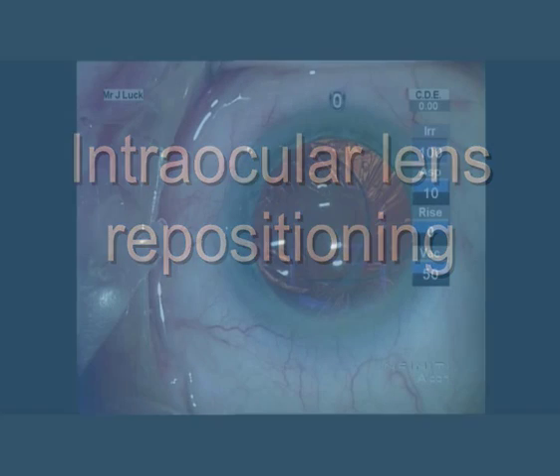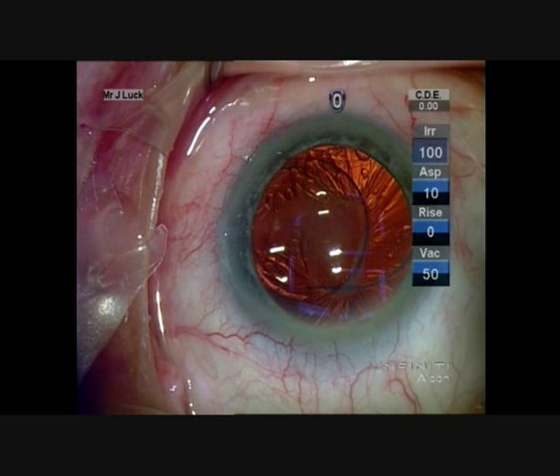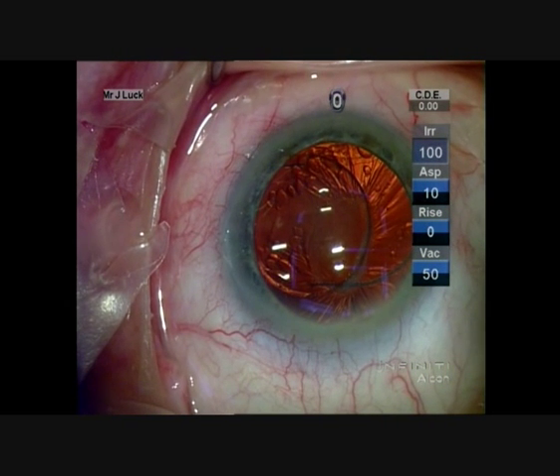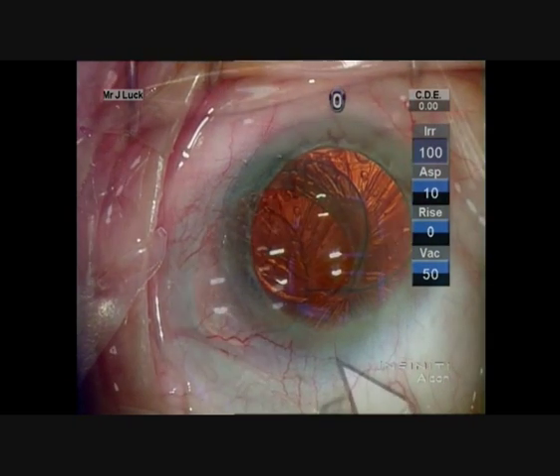Hello, John Luck here. This is a case of an intraocular lens repositioning that we did this week in an elderly, rather frail gentleman. The lens has been shifted over sideways by anterior capsular phimosis — it's part in and part out of the bag.